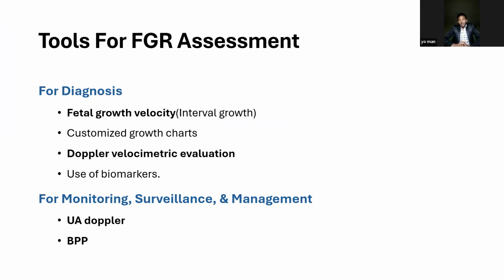So, until now, we were talking about the size, not the growth potential of the fetus. We don't know the growth potential of the fetus yet. So, if the fetus is below the 10th percentile in size for the exact gestational age, we have to look for the possible growth restricted pattern, okay?